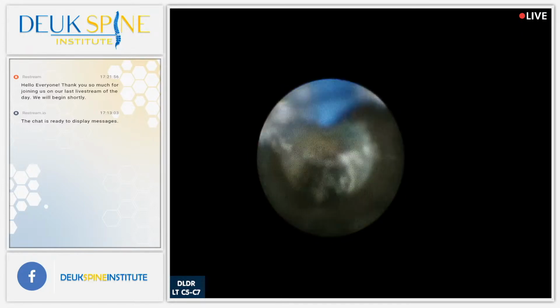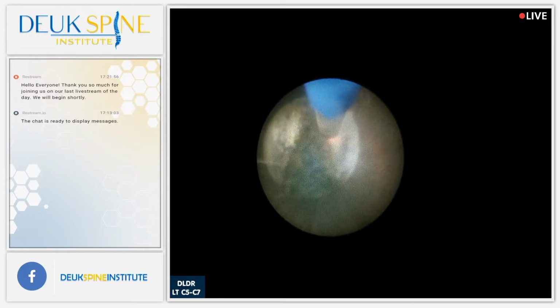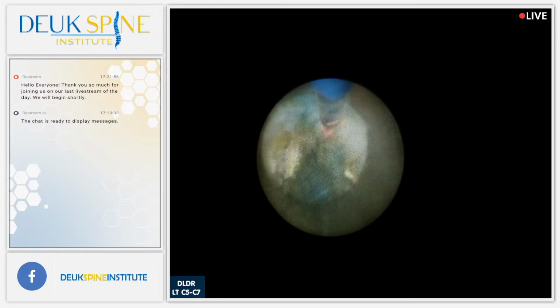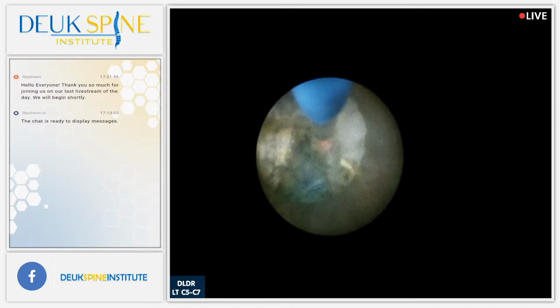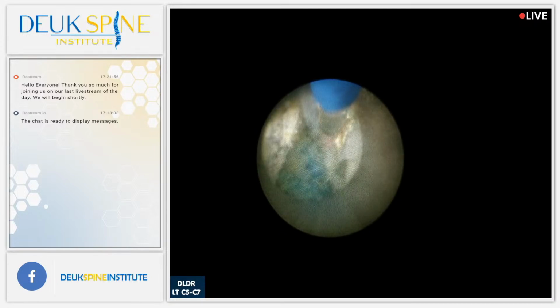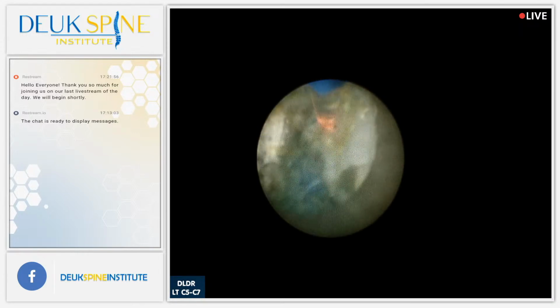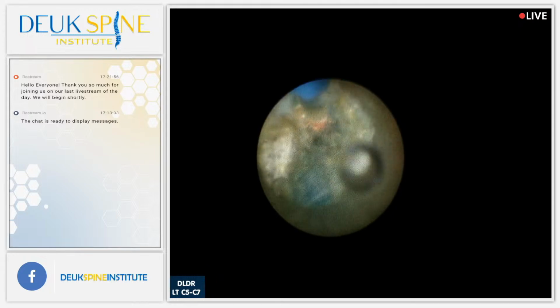You can turn it on right now. Scar tissue right here. DLDR will be here. Bone spurs. Again, struggling with her anatomy here. Trying to get up in that corner and it's just so hard. Thank you, Luis.